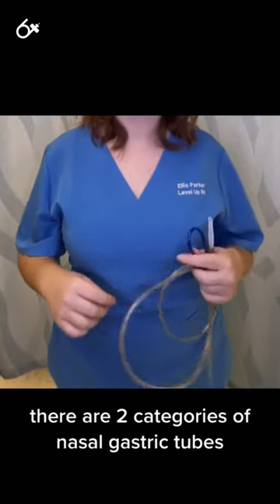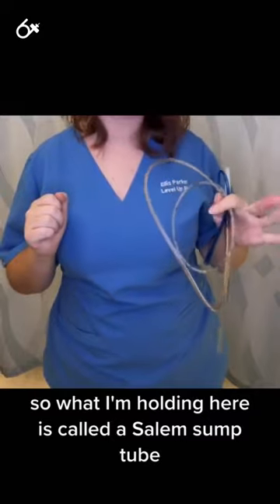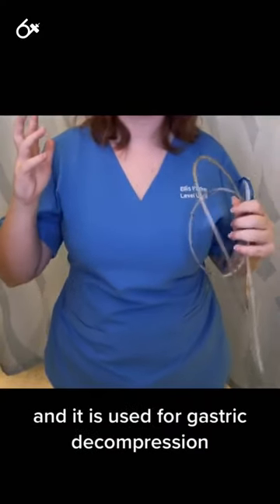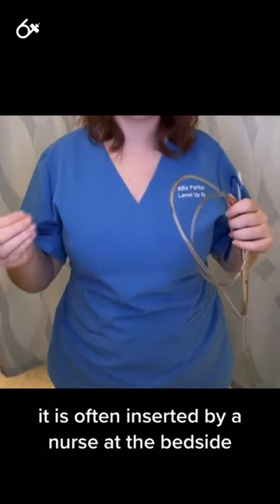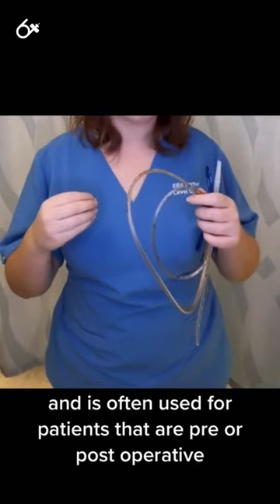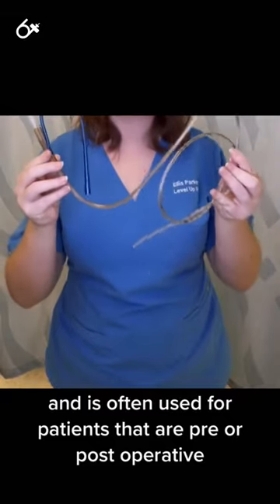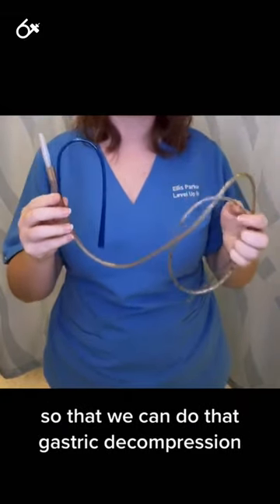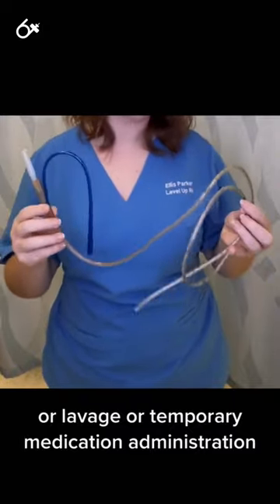There are two categories of nasogastric tubes. What I'm holding here is called a Salem sump tube, and it is used for gastric decompression. It is often inserted by a nurse at the bedside and is often used for patients that are pre- or post-operative so that we can do gastric decompression, lavage, or temporary medication administration.